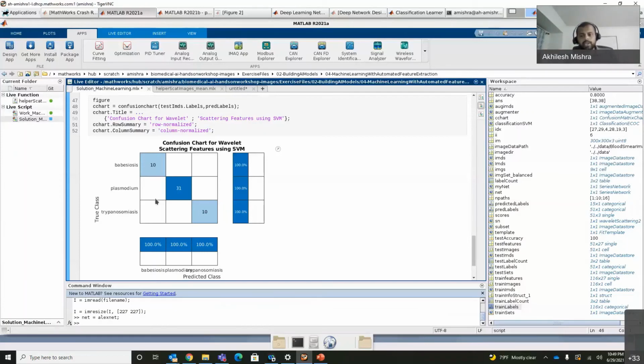And even if you go ahead and test more images, like get the precision, recall, and whatnot, you'll also see that with good feature extraction methods, you can train these models which give you much higher fidelity than what a simple transfer learning approach would give you any given day. So we'll take a pause again. Any questions at this point? Any more questions?